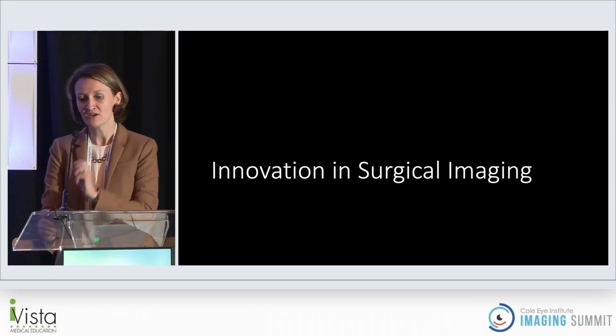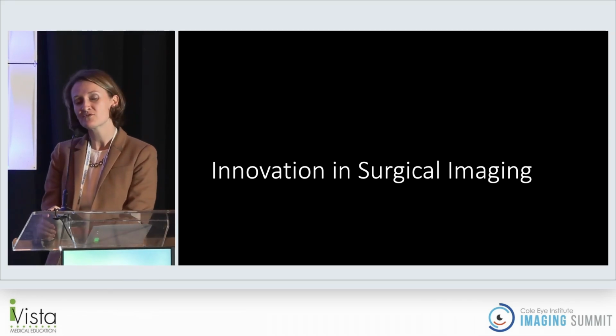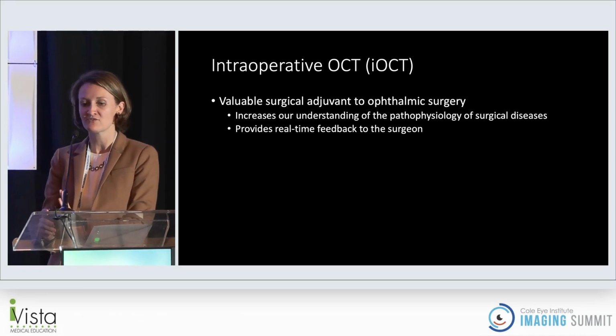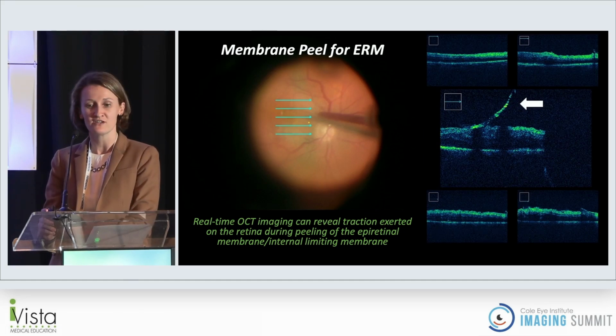So for my talk this evening, I'm going to talk about some innovations in surgical imaging, first talking about intraoperative OCT, then heads-up display, and then how we can utilize the two together. Intraoperative OCT is really a valuable surgical adjuvant to ophthalmic surgery that increases our understanding of the pathology of surgical disease and can provide real-time feedback to us as retina surgeons.